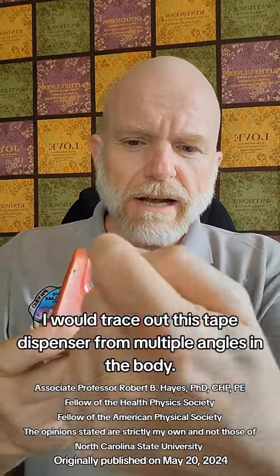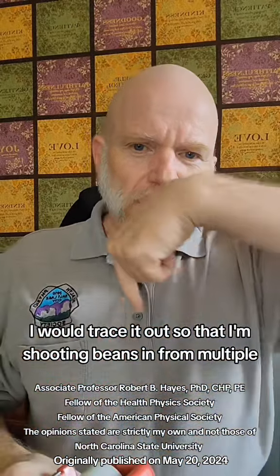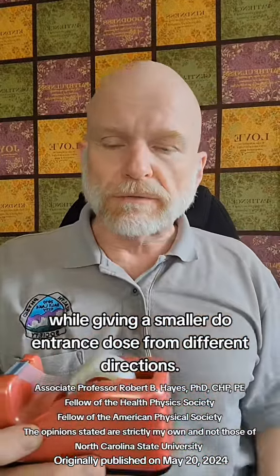For example, let's say that I had a tumor in my body somewhere that was shaped like this tape dispenser. What I would do is I would trace out this tape dispenser from multiple angles in the body. I would trace it out so that I'm shooting beams in from multiple different directions, so that as I'm tracing out this item from all of these different directions, I'm always giving a high dose to the tumor while giving a smaller entrance dose from different directions.